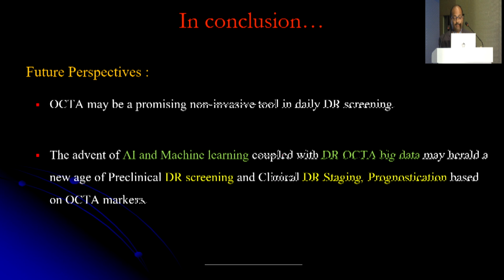Future perspectives may be that OCTA may be a promising non-invasive tool in daily DR screening, and the advent of AI and machine learning coupled with DR OCTA big data may herald a new age of preclinical diabetic retinopathy screening and clinical DR staging and prognostication based on OCTA markers.